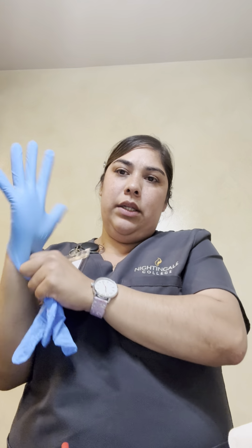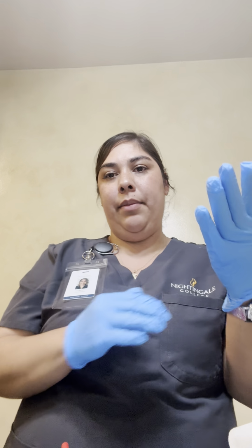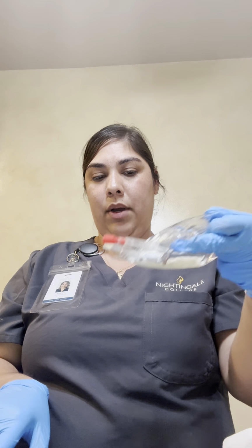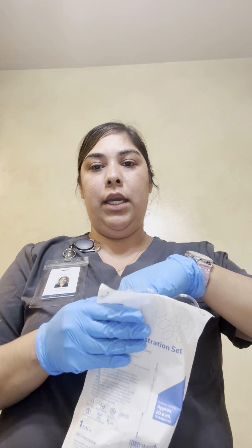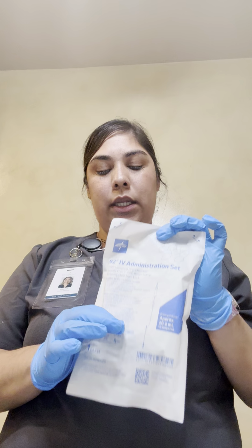My supplies include an IV tubing with a needleless Y site, a secondary IV tubing, a bag of primary IV fluid, which I have here. I have my amoxicillin here. I have my alcohol swabs. I have my IV port. These are the needle-free Y site tubing that I was talking about.